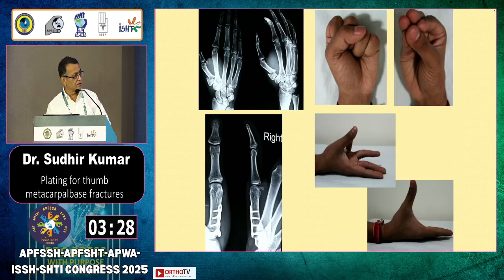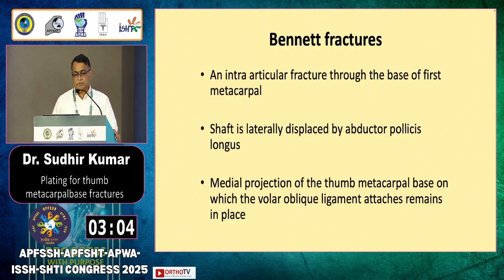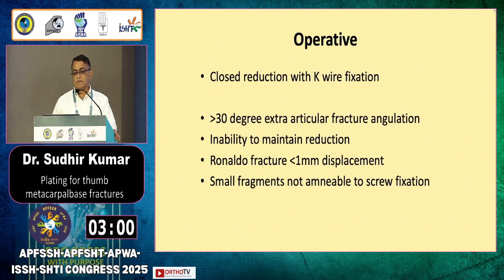Another example, which is an extra-articular fracture, we have done open reduction internal fixation by putting a Y kind of plate, and function at the end of the 3 years period. Here the patient came with a functional outcome at the time of implant removal. Usually implant removal is not routinely indicated, but if the patient is asking, this is one of the causes for implant removal.